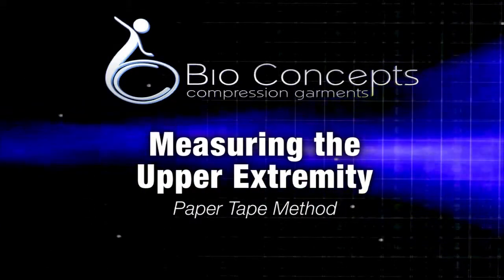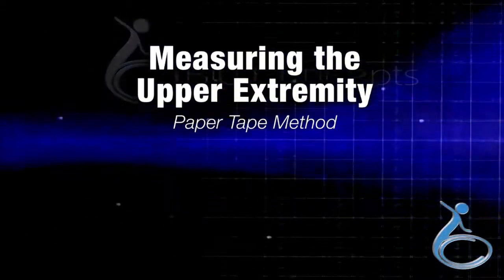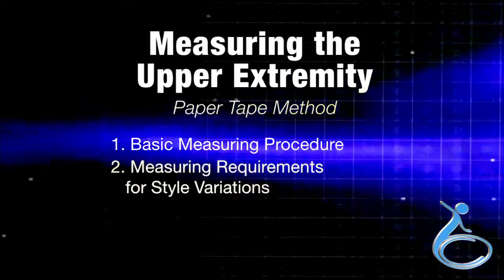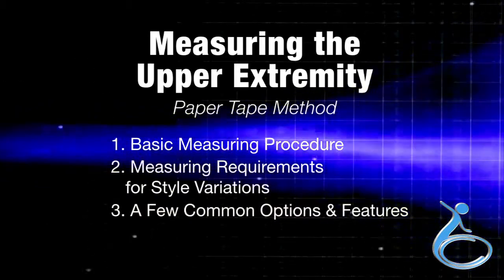This video will demonstrate measuring the upper extremity using the paper tape method. The video will cover three areas: basic measuring procedure, measuring requirements for style variations, and a few common options and features.